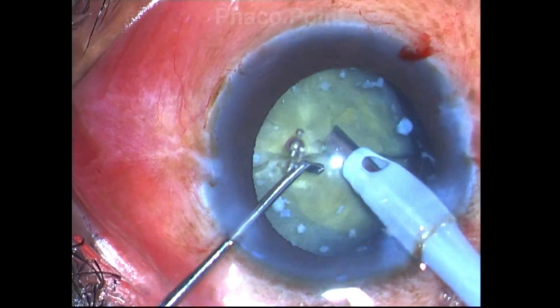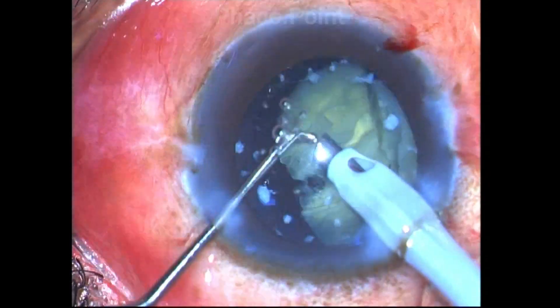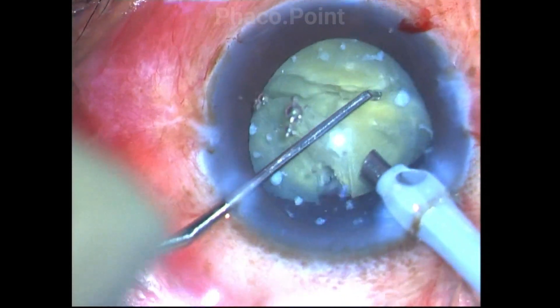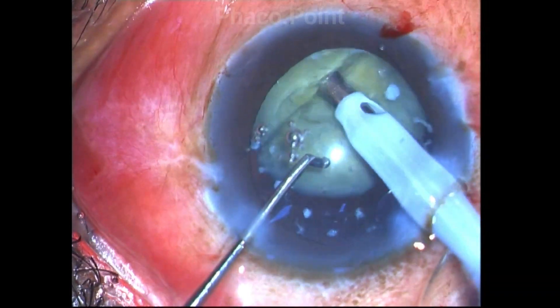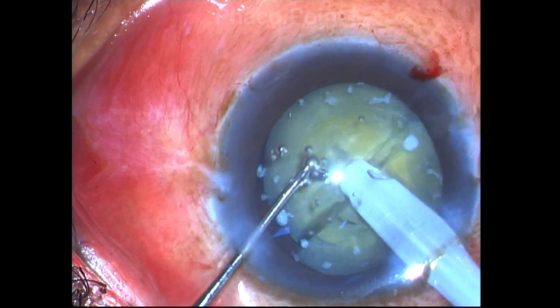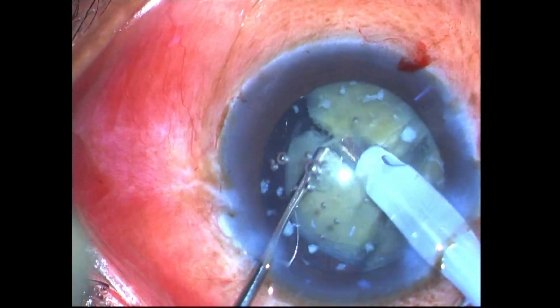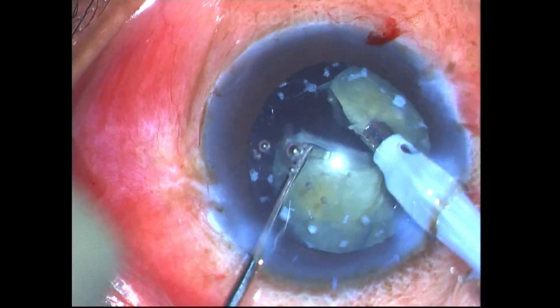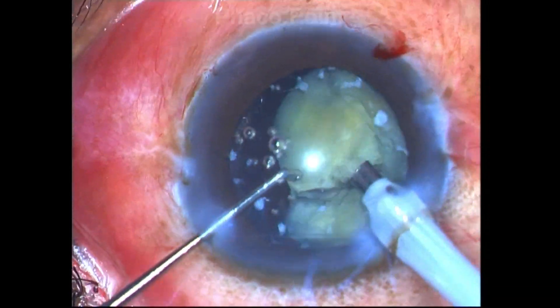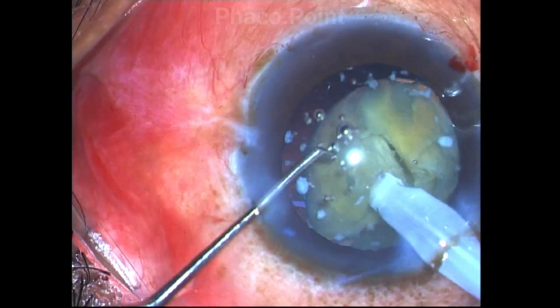I am not pressing too hard to separate the nuclear fragments because they still seem to be connected in the center. There is hardly any cortical or epinucleus cushion — the posterior capsule is just behind, and the bag is completely empty except for the small nucleus. If I suddenly lose occlusion, the posterior capsule can rise up and cause a posterior capsule rent. Which is why I am picking my way through very carefully without attempting too large a lateral separation. But in spite of this, using this blunt chopper, I am in good control of the entire procedure.